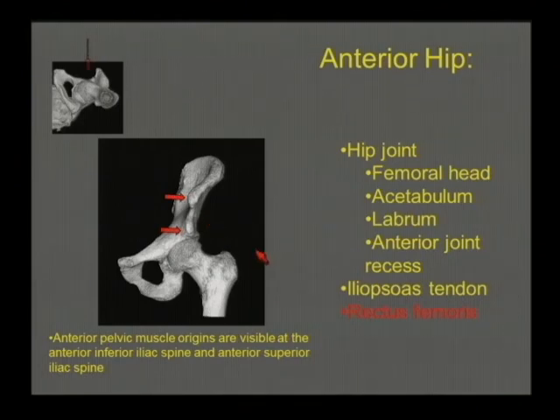When we're evaluating with ultrasound, commonly I'll palpate this area and try to identify these structures. Of course, you can bring the transducer and just scan over that area. And the anterior superior iliac spine in particular is typically just a little bit beneath the skin surface and readily identifiable. From there, you can scan down a little bit further and find the anterior inferior iliac spine.